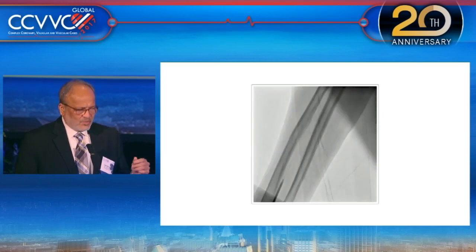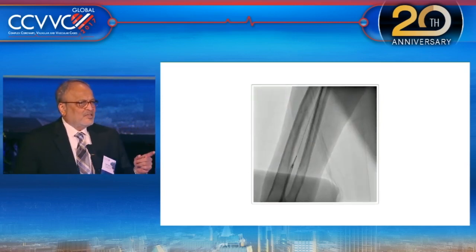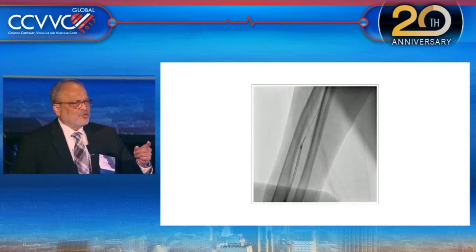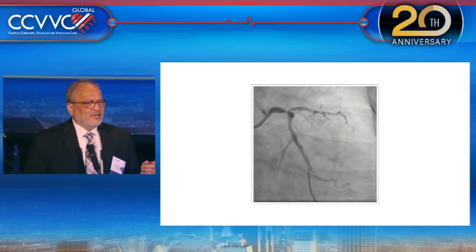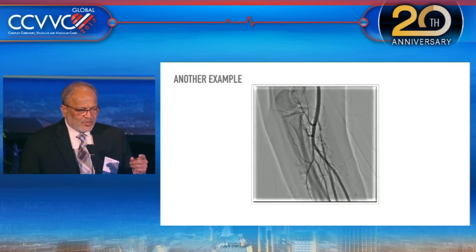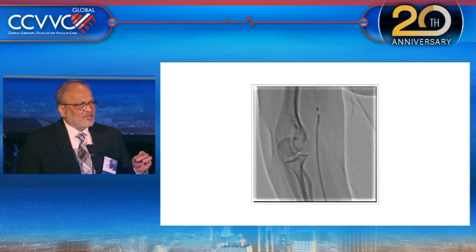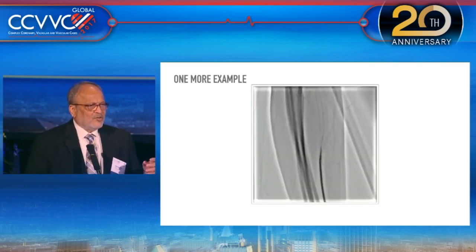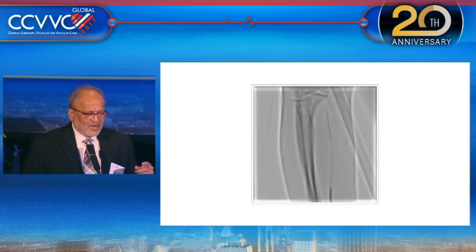After a couple of doses of cocktail, the spasm has been relieved but the artery is still very small and we need to perform a left main bifurcation using a 7 French guide. This is how the guide catheter moves with a 2 mm balloon protruded using balloon-assisted tracking, and the T-stenting can be done without much problem. Another example shows a very bad spasm at the junction — a setting for perforation — so balloon-assisted tracking must be used to avoid injury in that area. In a case of long spasm, a PTCA wire and balloon-assisted tracking can help.